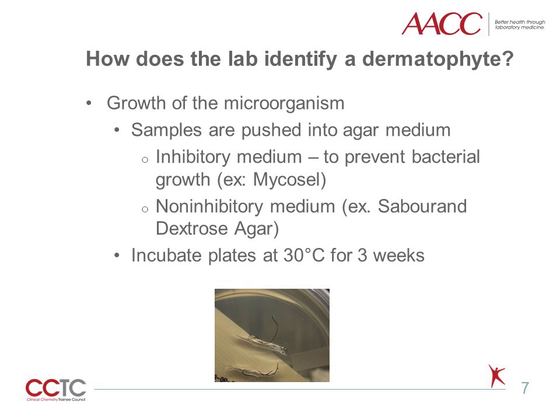So what does the lab do if a mold grows? The first step is to document the morphology or visually describe what the mold looks like on a plate and to determine if there is only one mold present. If there are colonies that appear different, the molds must be subcultured to try and isolate a single organism. This can be very difficult because mold spores are easily disturbed and dispersed, a trait that is very useful in the environment.